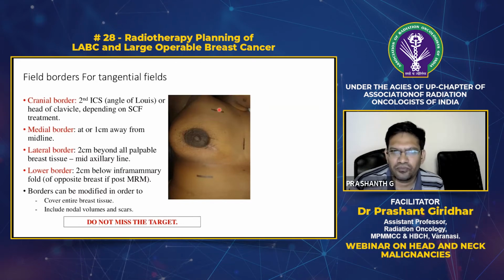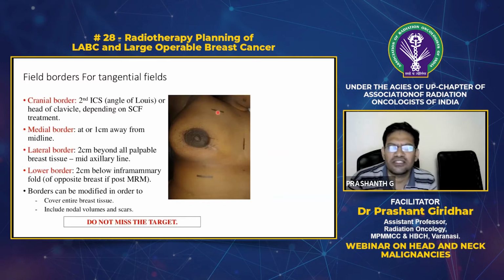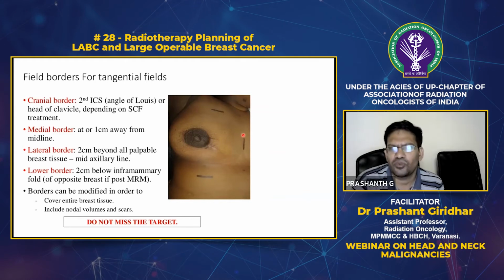Step two, before we place the patient in the X-ray, before we start taking the X-ray simulator image, is to measure this Y-axis. So the Y-axis usually is around 16 to 20 centimeters, depending on the height of the patient. So 16 to 20 centimeters, and then you open an arbitrary field that is in the X-axis around 12 centimeters or so.